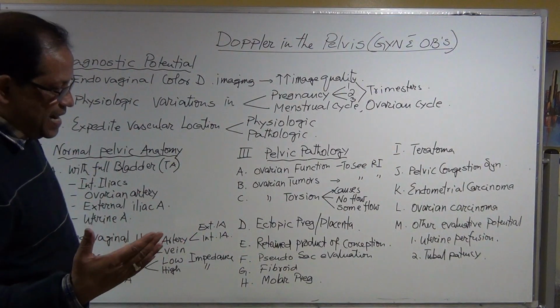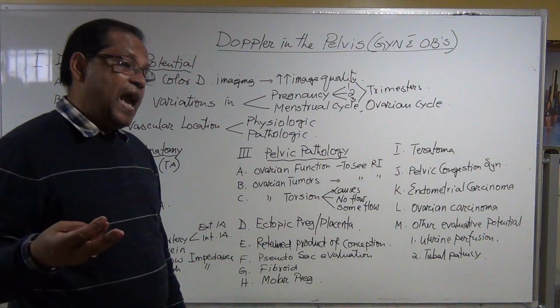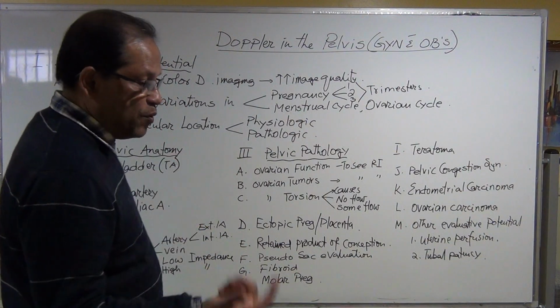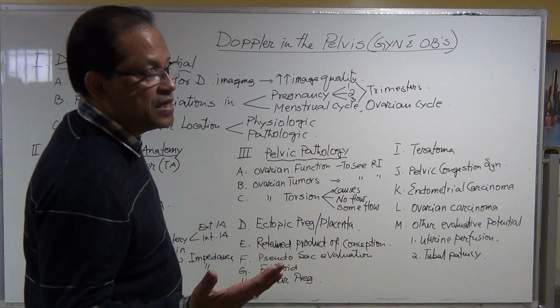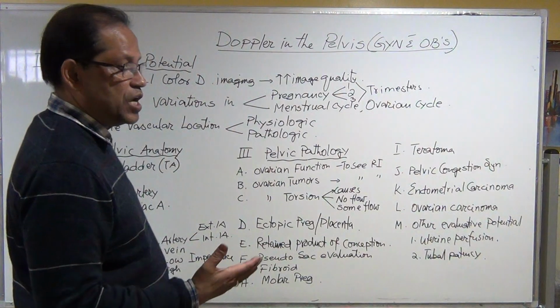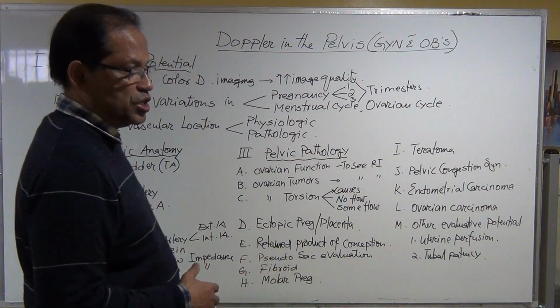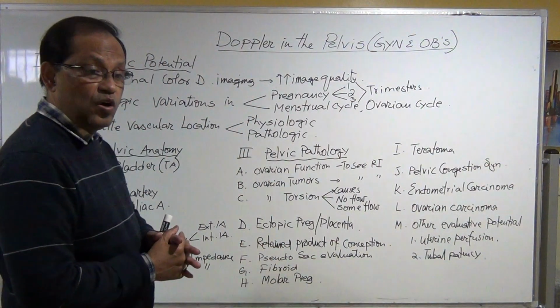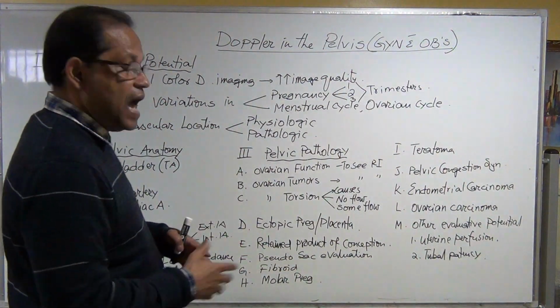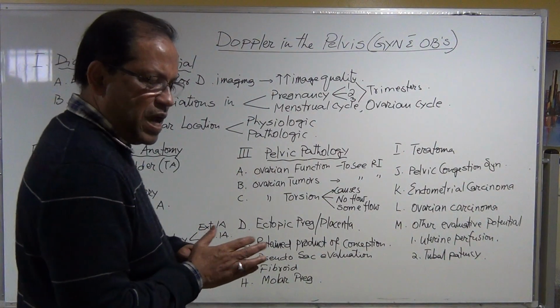Doppler application can identify hypovascularity, no vascularity and hypervascularity. And the hypovascularity is due to the lack of blood flow, ischemic changes, partial obstruction, or there might be no flow at all during complete obstruction. Can we see all those flow conditions and the obstruction in the ultrasound? Yes. And hyperfunction, hypervascularity, can we identify the hypervascularity?